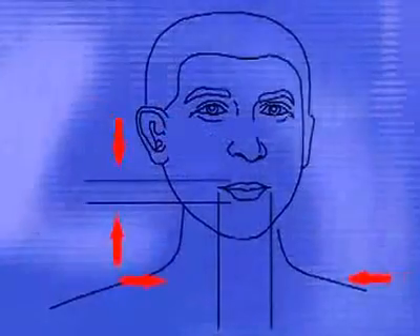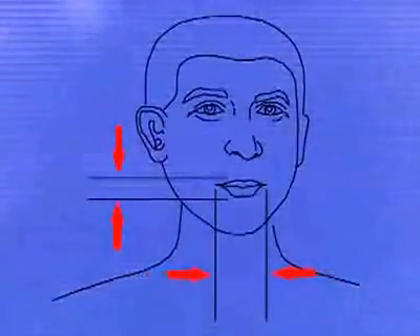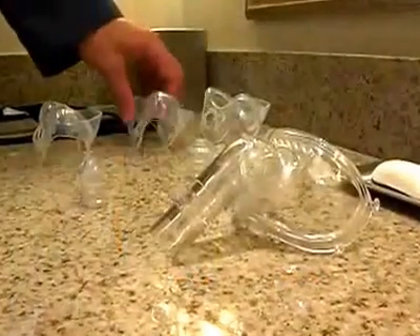To determine the appropriate oral cushion size, visually inspect your mouth, then choose a corresponding oral cushion. Place the cushion over your mouth and inspect for adequate clearance around the lips. The upper section of the oral cushion should rest completely above the mouth on the upper lip, and the chin flap should fit under your chin.